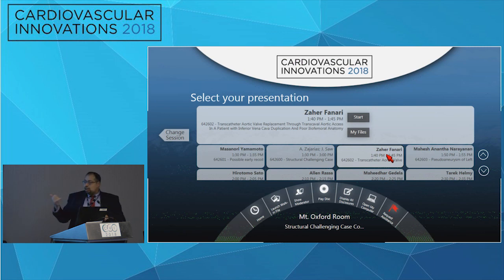So we actually started doing this balloon there, and you're right, if you look at the registry, even the original first 100 cases have like 60% flow. But many centers are doing this now. We did like 20 transcavals so far, and our rate is only 5% because of this. Whether this helped or not, I don't know, but in this case she's so obese, we were worried about bleeding, and we were worried about the figure of 8 not being enough.